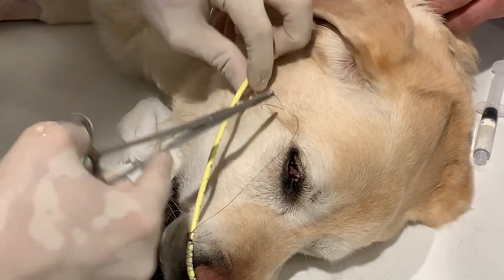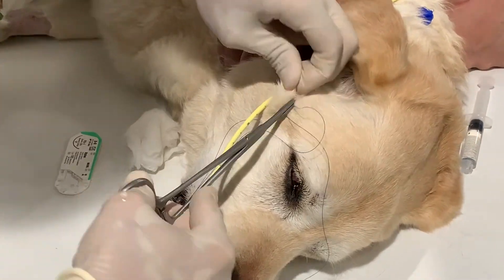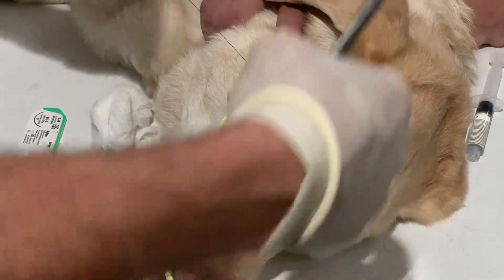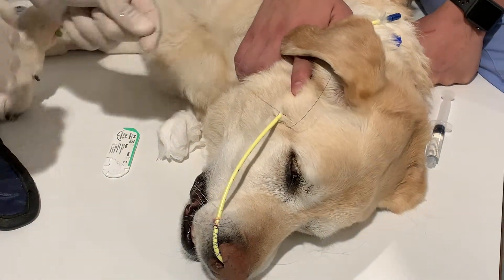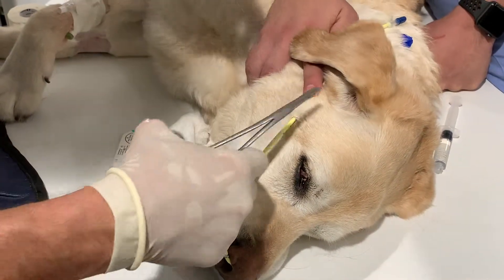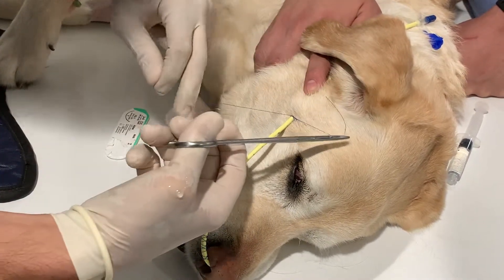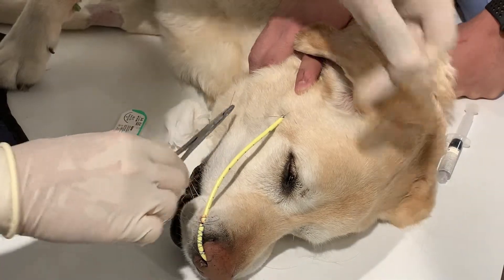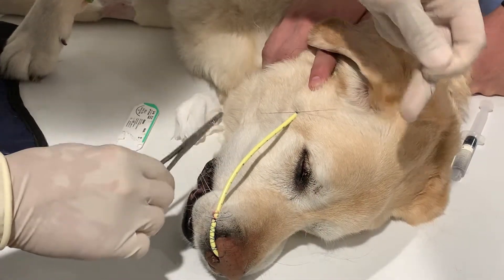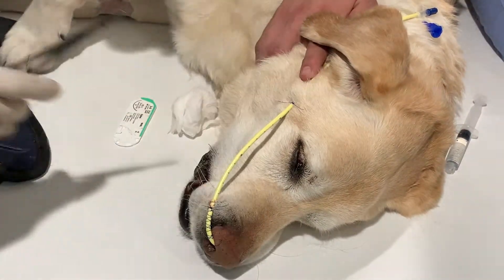Then I'm going to take another big bite. Again, if you see any bleeding, it's okay — it'll stop on its own, it's just like getting a blood draw, just a little pinch. That'll really secure it nicely. We'll make sure it's a little bit snug but not too loose either. Do a surgeon's throw. We've got it secure. This is just an added measure to make sure we don't dislodge the feeding tube. Leave the tags kind of long so folks know it's actually secured there when they have to remove it.